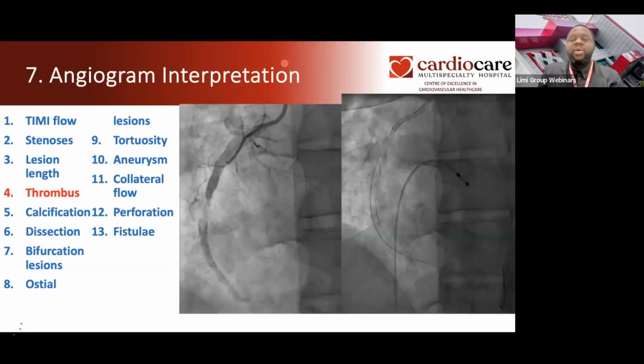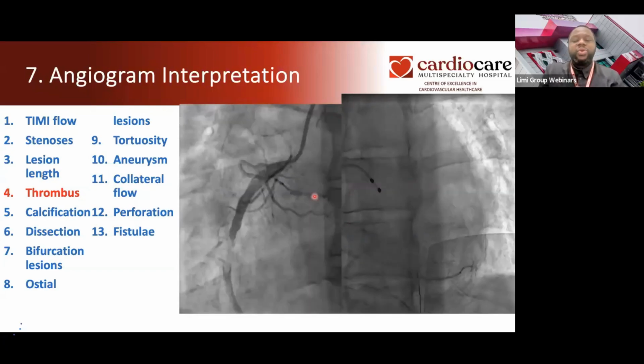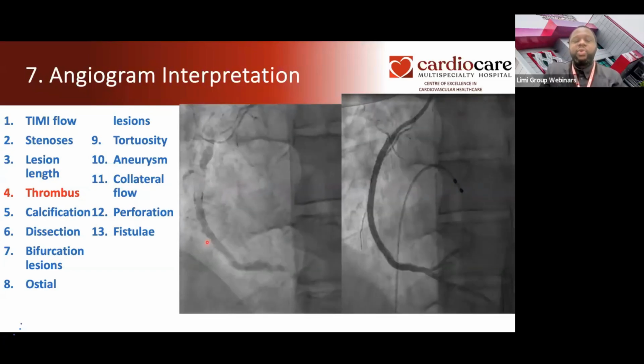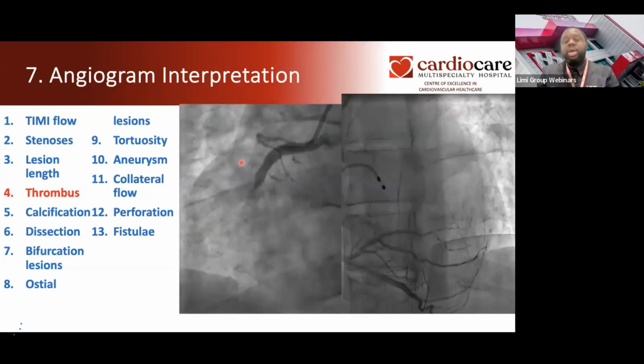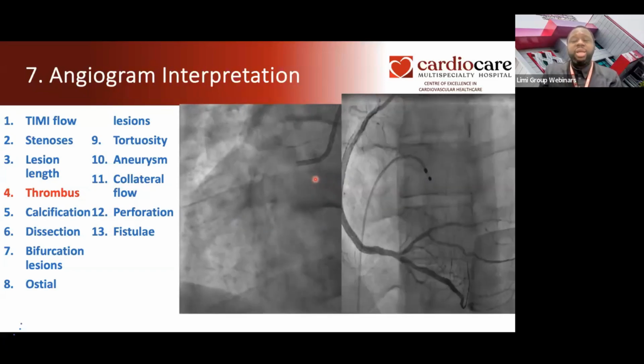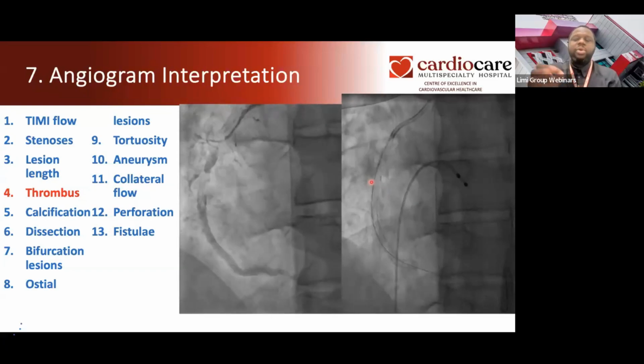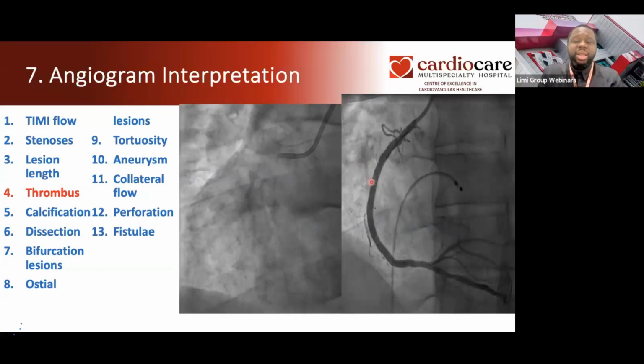So this is a wire of a temporary pacemaker. So when you are doing the right coronary vessel interventions, remember the right coronary is most times the one that supplies the AV node and the SA node. Patients can have asystole. That clot can move and enter one of the small vessels. They can have an AV block.